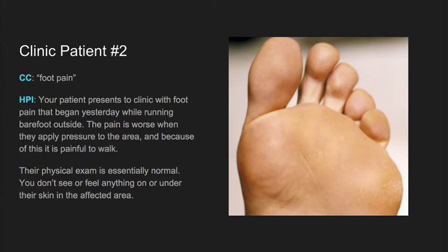This patient comes in complaining of foot pain that began yesterday while running barefoot outside. Pain is worse when they apply pressure to the area and when walking. Their exam is basically normal and you don't feel or see anything on their physical exam. So, this being an ultrasound podcast, let's ultrasound.